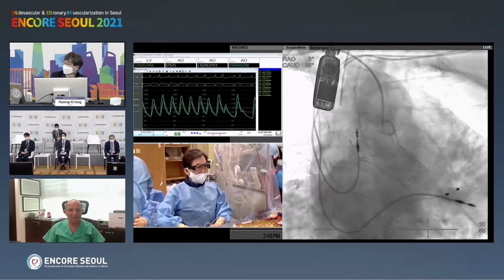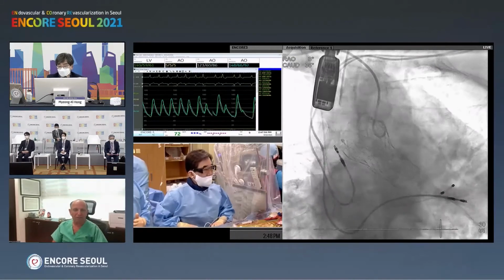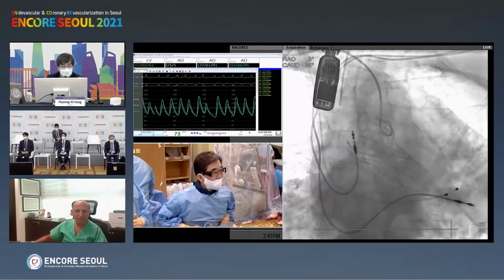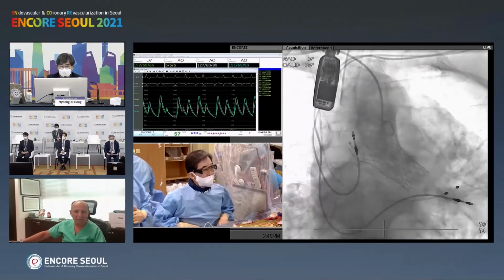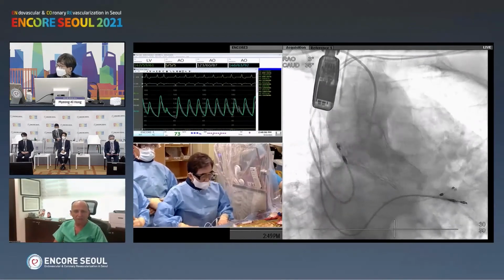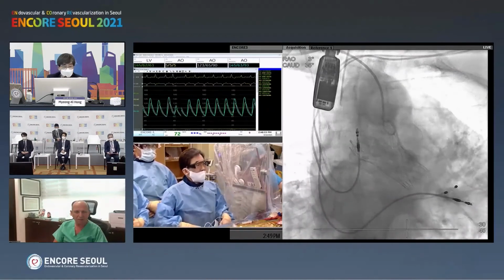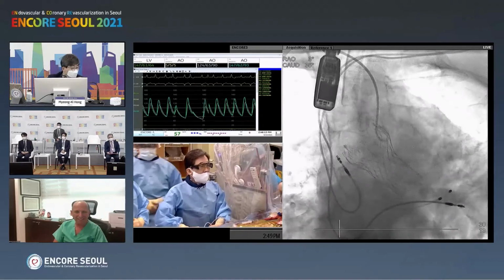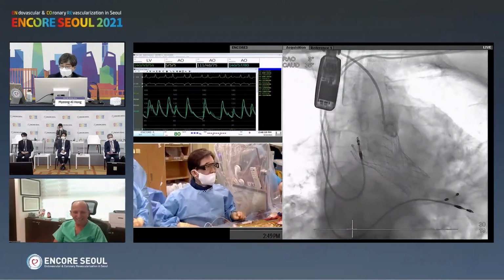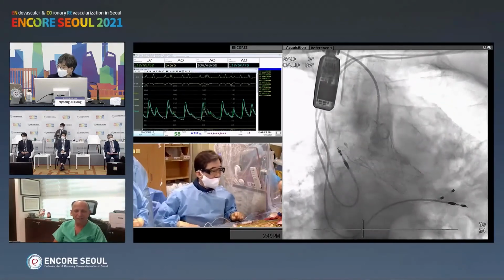One is that I noticed in some parts of the implantation, you implanted the valve with your left hand and you controlled the wire with your right hand. Am I right? Are you the only control freak more than me in the world? Because I always insist the first operator should manipulate sheath and wire simultaneously. Thus, we call it control freak.